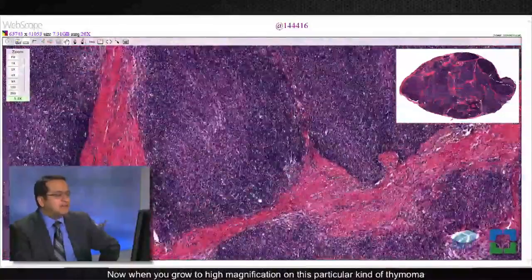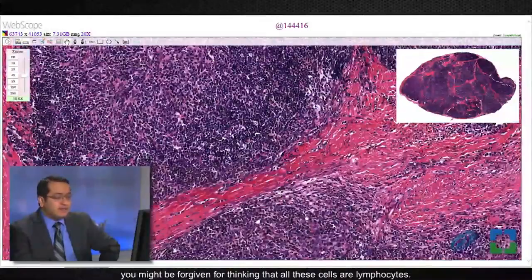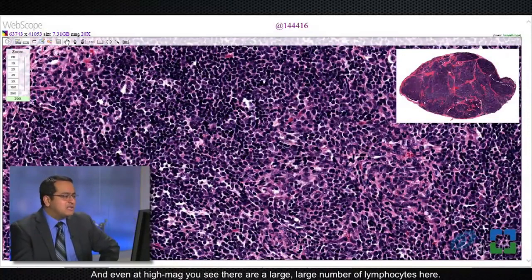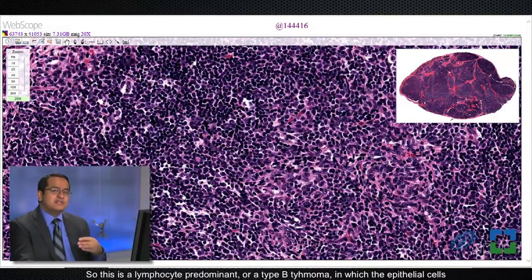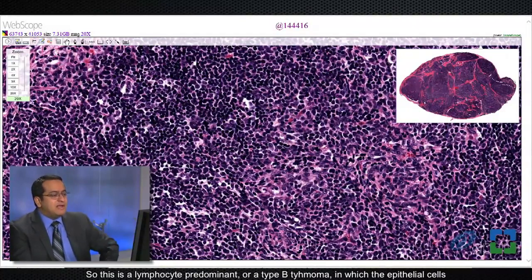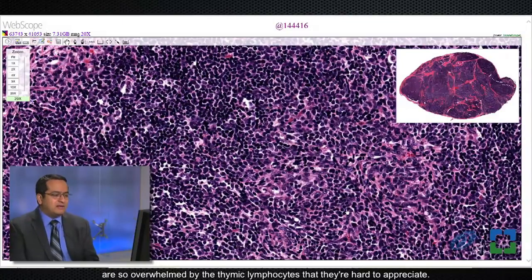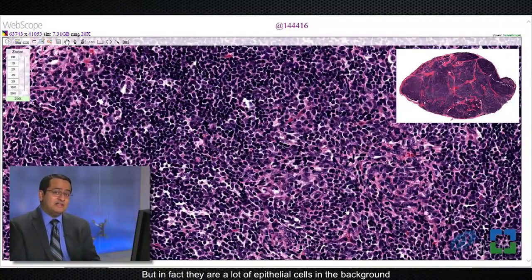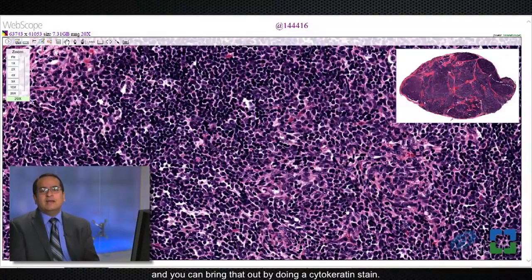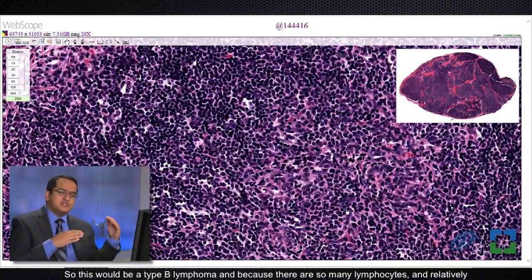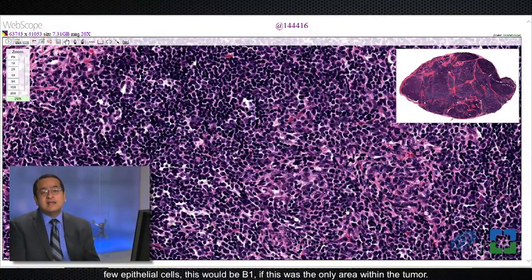At high magnification on this particular thymoma, you might be forgiven for thinking that all these cells are lymphocytes, because it certainly looks that way at low magnification and even at high mag you see a large number of lymphocytes. This is a lymphocyte-predominant or type B thymoma, in which the epithelial cells are so overwhelmed by the thymic lymphocytes that they are hard to appreciate. In fact there are a lot of epithelial cells in the background, and you can bring those out by doing a cytokeratin stain — AE1/AE3 or any cytokeratin stain will bring out the background epithelial cells. With so many lymphocytes and relatively few epithelial cells, this would be classified as B1 thymoma.